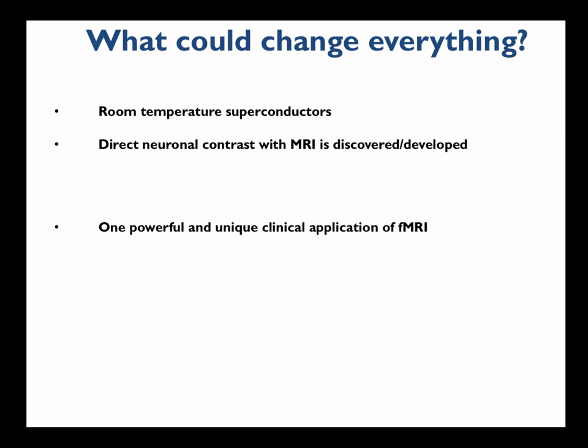For instance, if we develop a new pulse sequence, like some brand new one, like VASO, for instance, it's not a product. There's no way of getting it propagated other than with research agreements with vendors, and then you can share maybe with one or two other people or groups. So it's not spread or tried as rapidly as it would be if the vendor cared about that. So that's a key thing, and I think that would change everything.